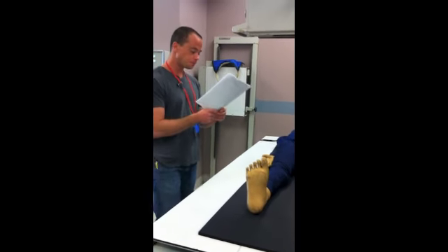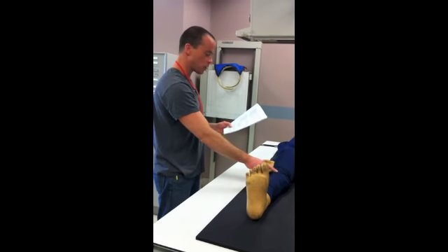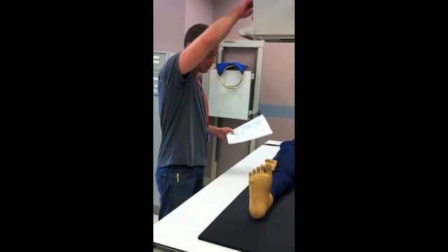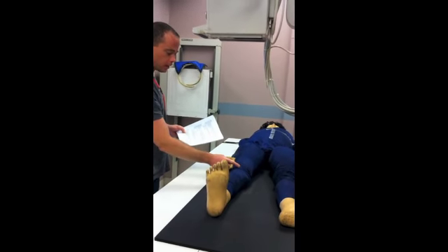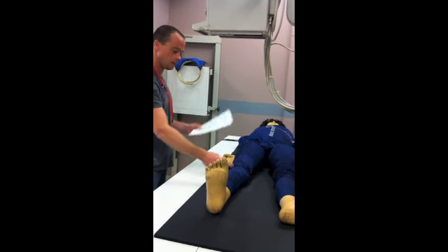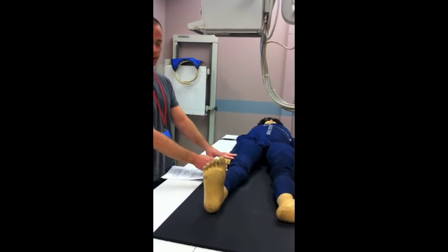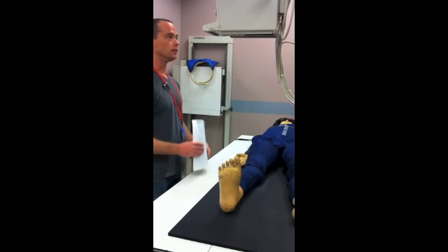Now, the central ray enters roughly half an inch inferior to the patellar apex. Here's the patellar apex, and here's where the central ray enters. So I have that correctly. I've got a few inches of tib, fib, and femur on each side.